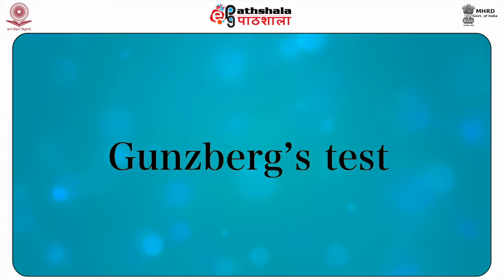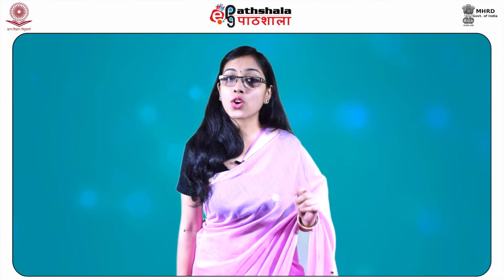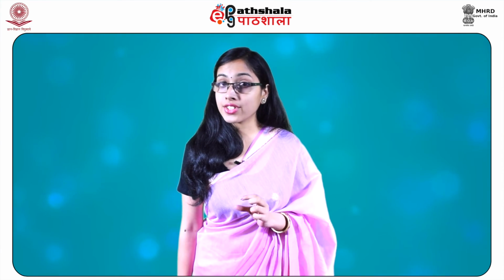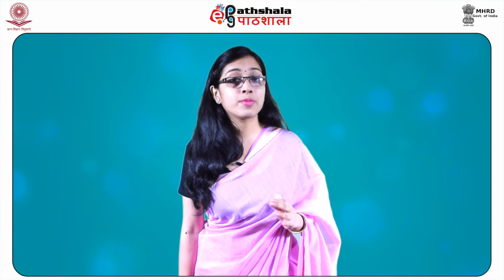Next is Gunzburg's test. A few drops of Gunzburg's reagent, that is prepared by dissolving 2 gram of phloroglucinol and 1 gram of vanillin in 100 ml of 95% alcohol, is taken in a porcelain dish and evaporated to dryness over a small flame and then cooled down. A glass rod together with the material to be tested is added to the dried reagent and warmed gently. A purplish red color develops in the presence of free hydrochloric acid.